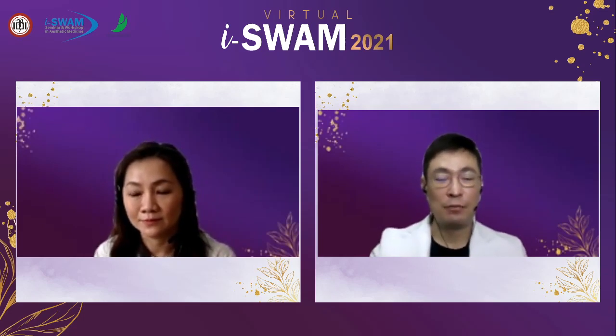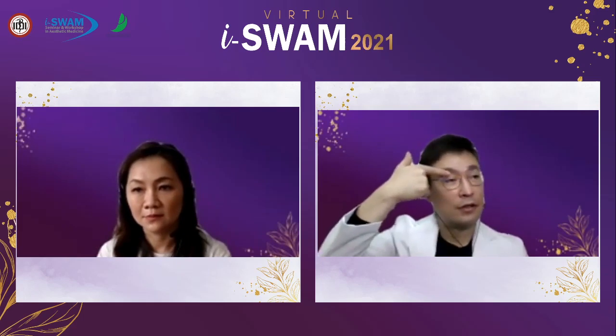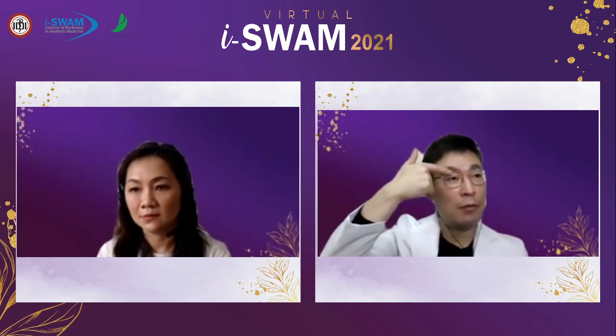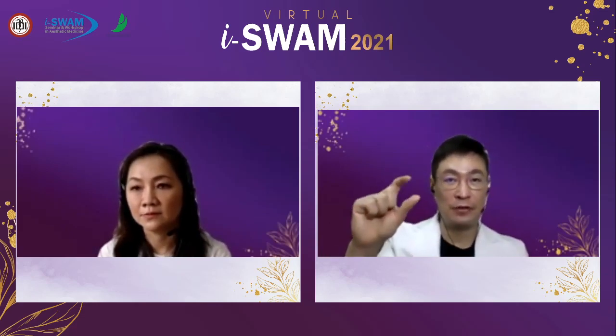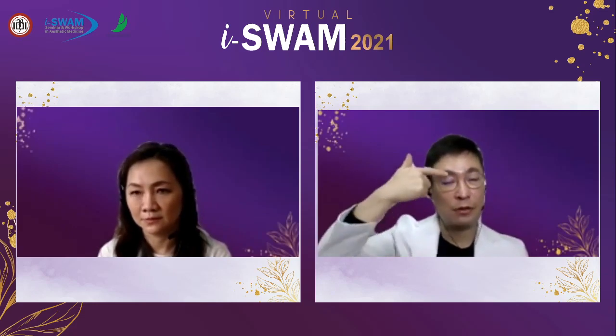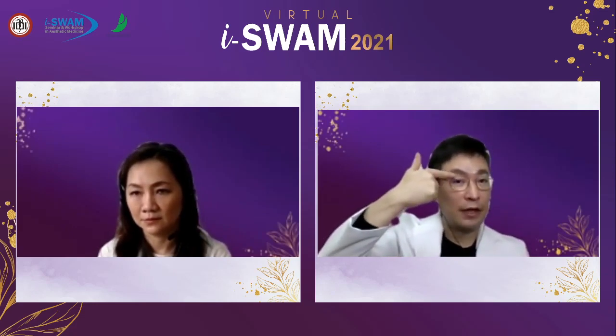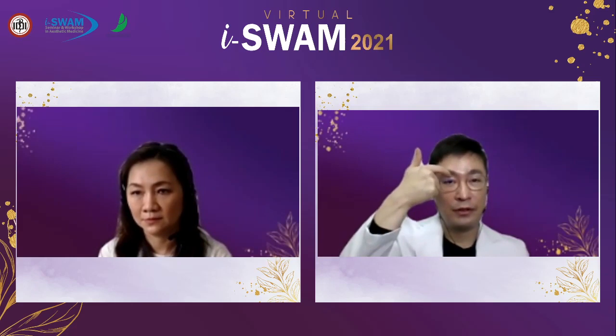Okay, the insertion point is first just the lower margin of the lateral eyebrow. Usually the eyebrow thickness is around 2 centimeters, or sometimes thicker than 2 centimeters. Anyway, the lower part is here, and from the mid-pupillary line, I usually put the lateral part.